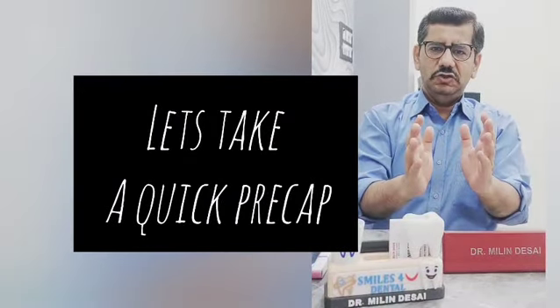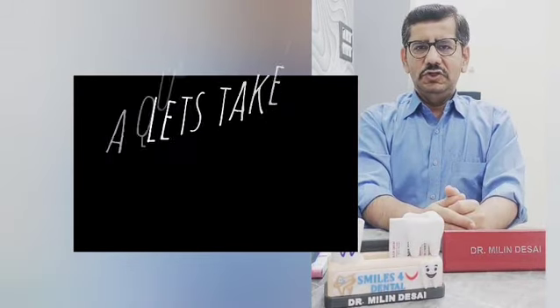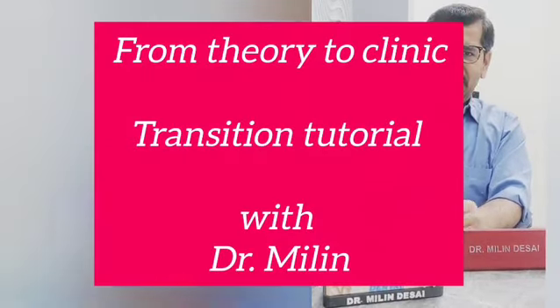Your access should welcome the files and not trap them. Short burr is the key.